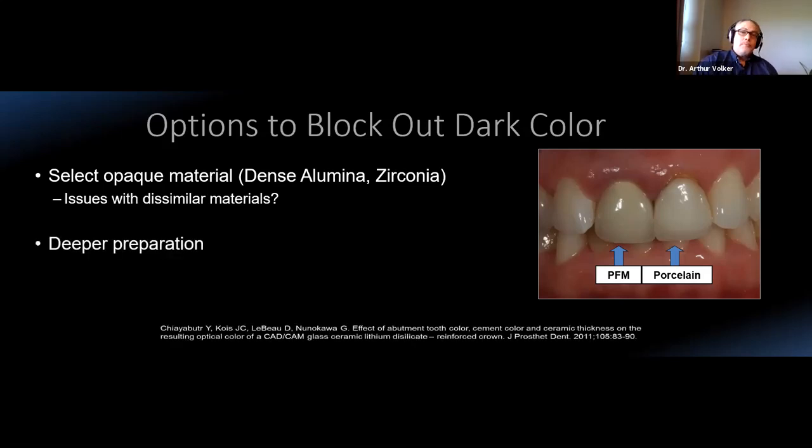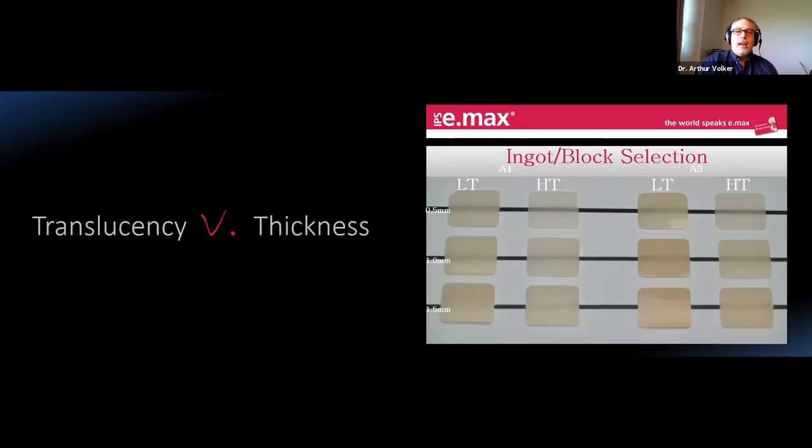We can prep more. Definitely you can prep more aggressively, and there have certainly been studies to show that, and I'm going to show you a quick guide about that. So you can prep more aggressively, but is that something that we want to do ethically? I prefer not to. I prefer to, again, advocate minimally invasive dentistry whenever I can. And here's what I mean.